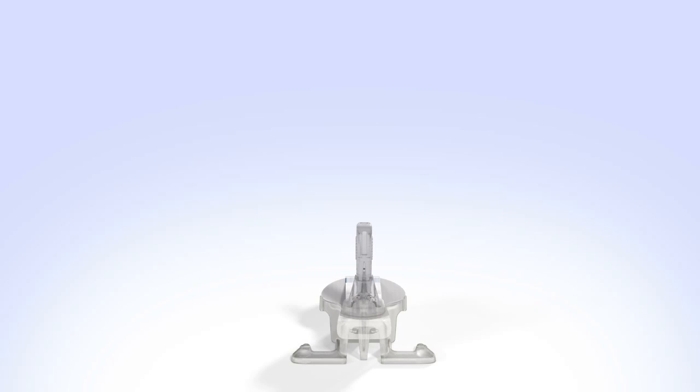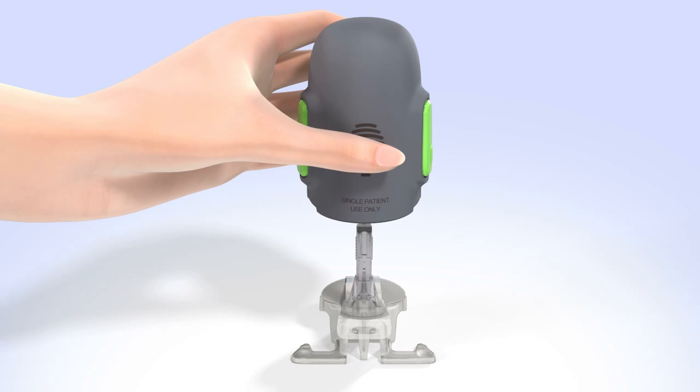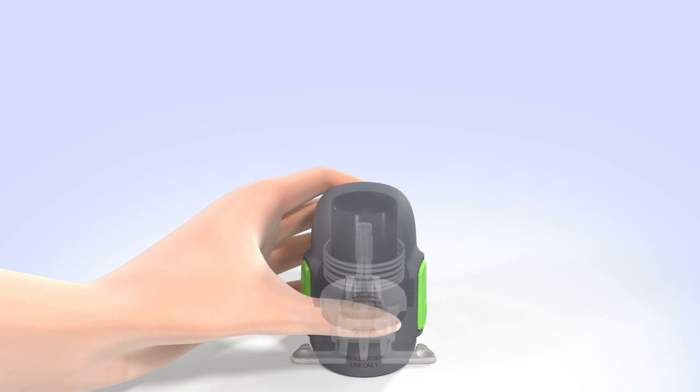Hold the serter so your thumb is on the thumbprint. Be sure your fingers are not touching the green buttons on either side of the serter. Carefully push the serter down onto the sensor and pedestal until the base of the serter sits flat on the table and you hear a click. Do not push the serter too hard onto the sensor, as this might cause the sensor to load improperly.